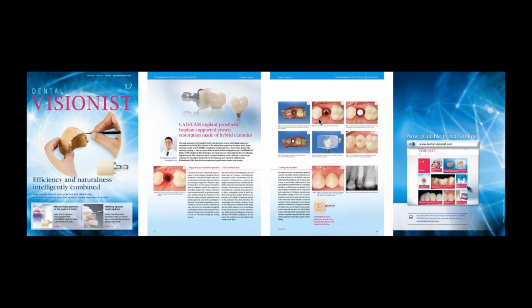Then we will just go ahead and make a conventional scan of the opposing arch, and then a buccal scan as well to get all the different files correlated together, and then we will design the monolithic restoration and mill it with the Enamic implant solution block.